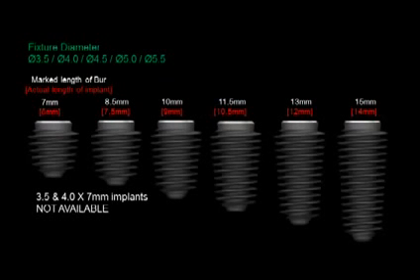A lot of the little nuances about the AnyRidge system will really make your life a lot easier. Like we talked about earlier, the actual length of the implant. First, let me talk about the sizes. Now, the 3.5 and 4.0 do not have the 7mm length, as far as the length of the implant. Starting at your 4.5 through 8.0, we do have a 7mm length implant.